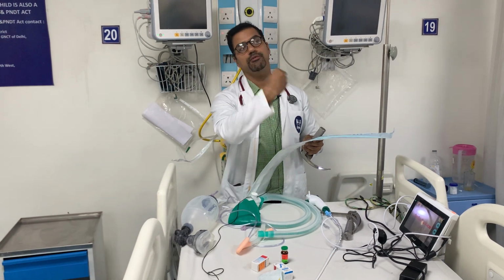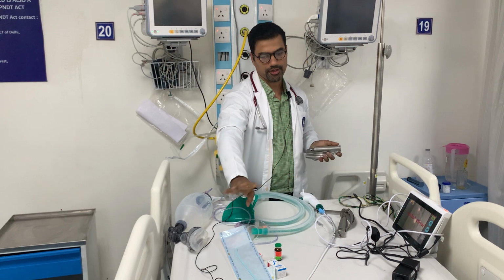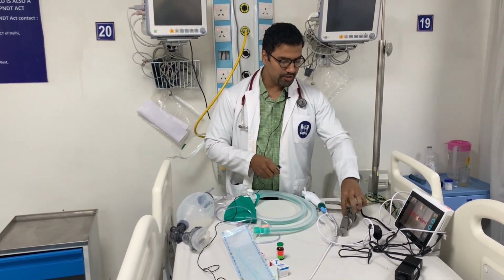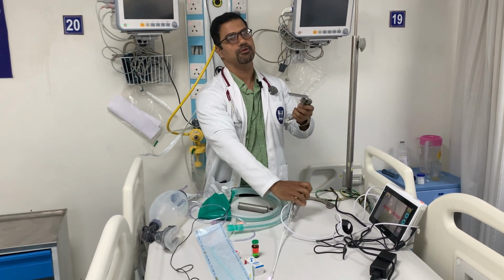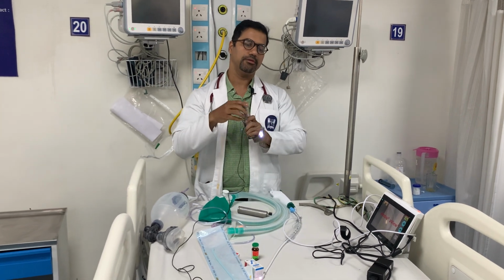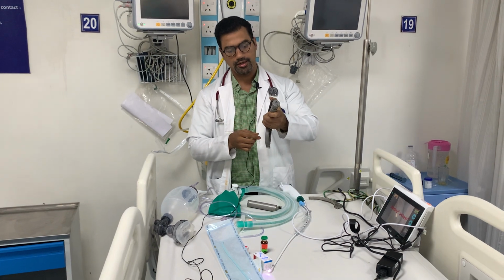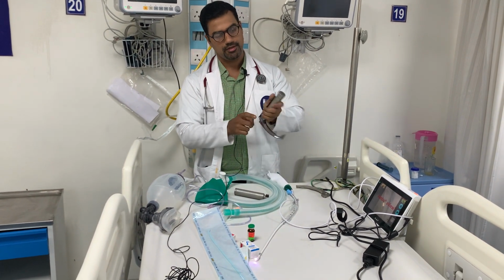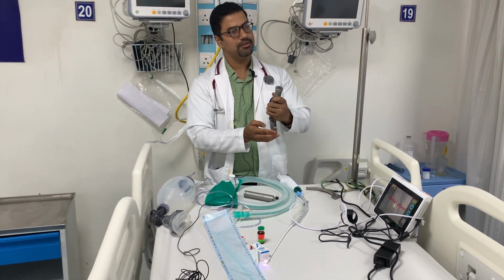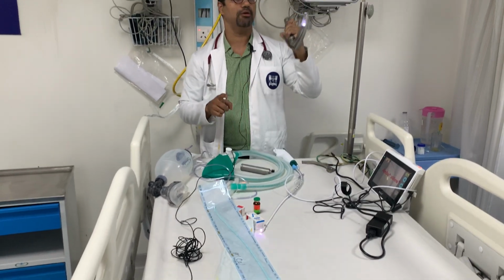Okay. Supposedly even that is a failure. What do you do? You have tried the bougie, you have tried the stylet, but both of them are failures. What you can do is, you can use the McCoy laryngoscope. This is the McCoy laryngoscope. It will increase the visibility by almost 1 grade. Okay. You go inside there like a normal laryngoscope and then just push the trigger. This is the trigger. If you push the trigger, it will increase your visibility. So you can try again using the bougie or the stylet by using this McCoy laryngoscope.